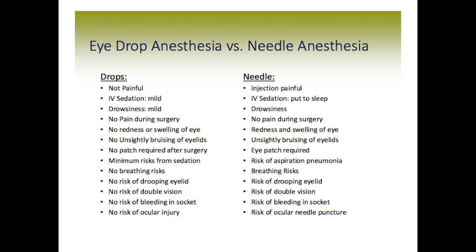Then there's also the question of damage to the eyelids, where numbing drops are not going to do anything to the eyelids, but there is risk of the needle injection, which is being used around the eyelids to numb them, to have some permanent drooping of the eyelids. Again, not common, but it can occur.